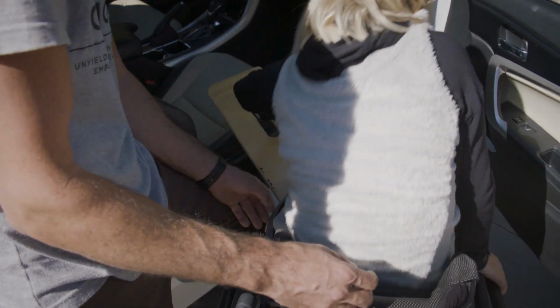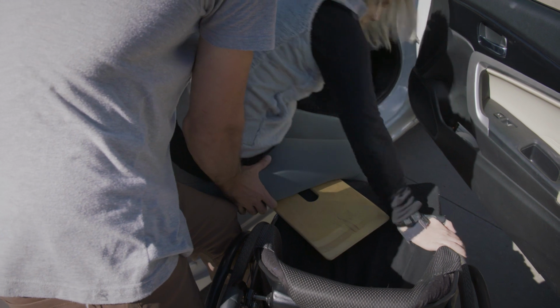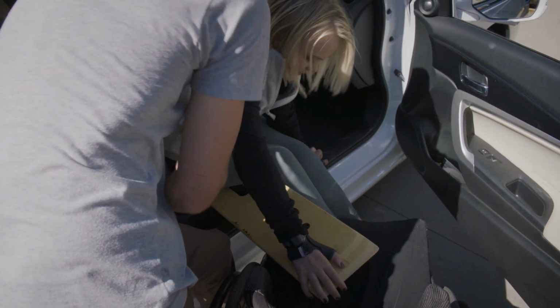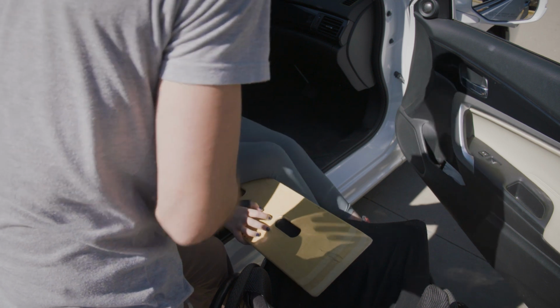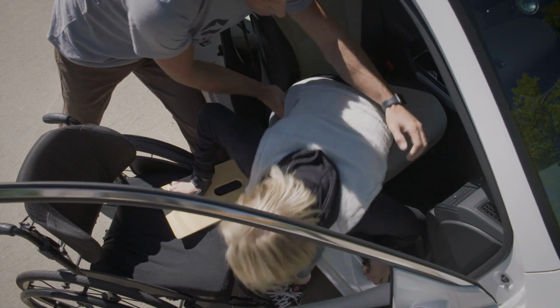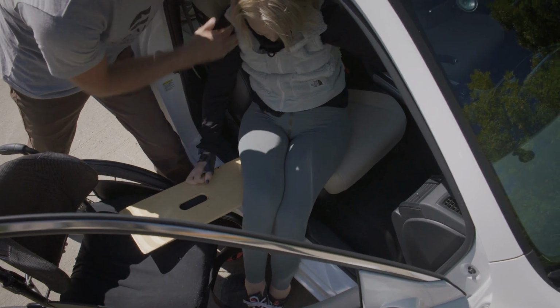The assistant can help guide the hips across the slide board as the passenger leans forward with her head down. Make sure to avoid hitting the wheelchair tire and car frame as you make this transfer. The passenger's hips will enter the car first. Make sure the passenger keeps her head down to avoid hitting the door frame.